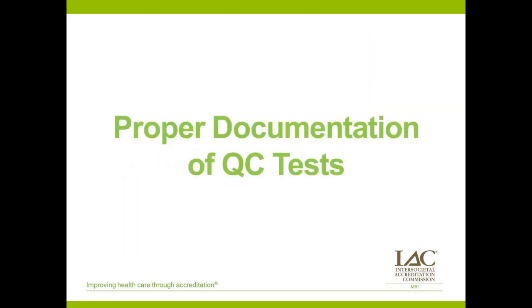So in reviewing accreditation submissions for facilities applying for MRI accreditation or MRI accreditation renewal, a large amount of the documentation that's being submitted is documentation of these QC tests to show that they're being done on the proper frequency, to show that they are meeting the standards that are set forth by the MRI manufacturer in terms of the performance of the system, ultimately with the goal of ensuring that the system is ready to do the best work possible to produce quality patient images.